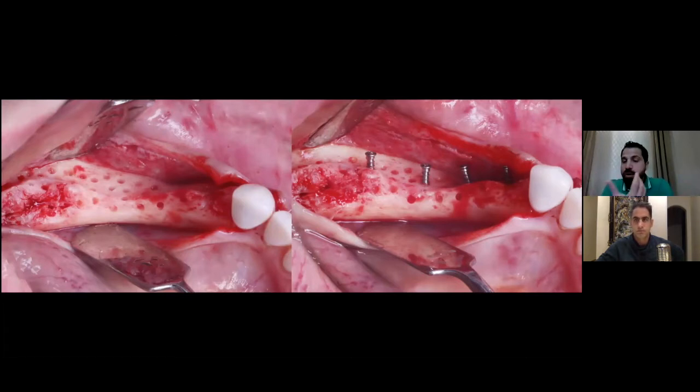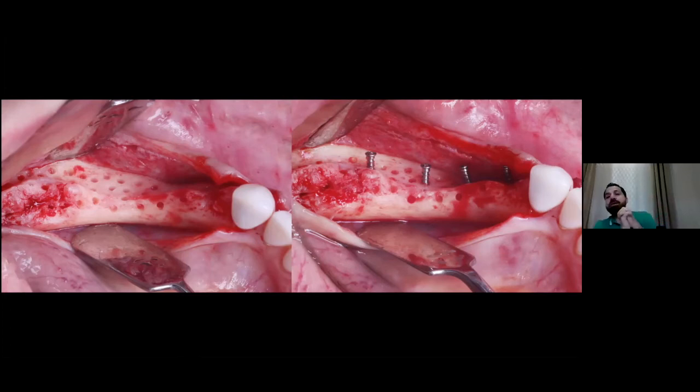Important things to talk about here are the tenting poles. The data that we have from the studies is that with GBR, you're going to get 3 to 4 millimeters. If you get 5 millimeters, it will be tremendous. But usually you have this range of 4 millimeters. It doesn't really make sense to place your tenting pole beyond 4 millimeters. So 4 to 5 millimeters will be great. You don't need to put it 6 or 7 or 8, because you're not going to get this much.